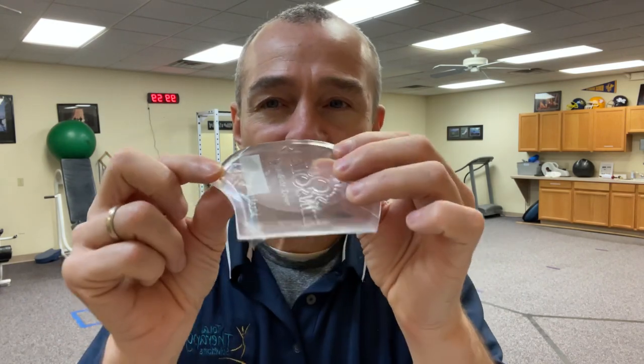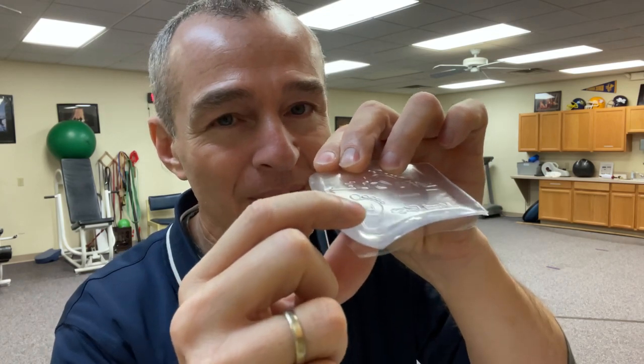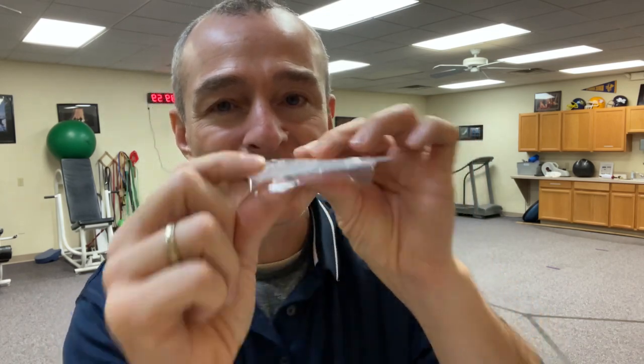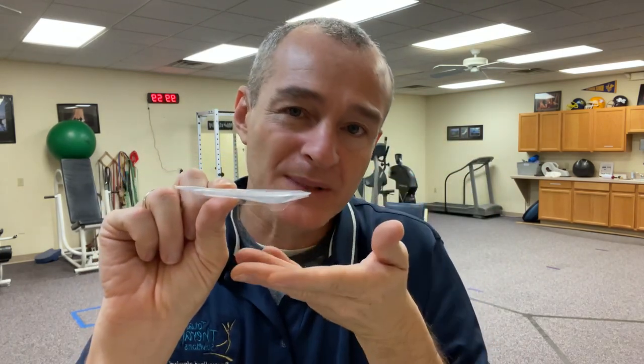Another little trick: there's a foot graphic on here, and there's a little 'L' that tells you this is a left-side orthotic. So it's going to go in the left shoe, flat side up, dome side down.